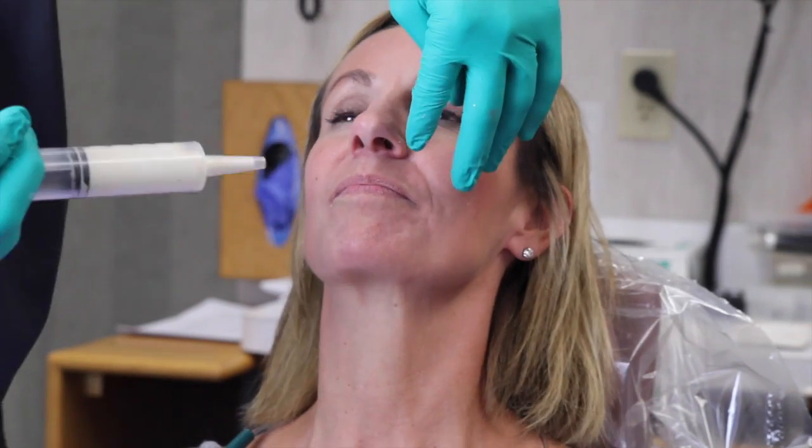And I'm going to wait a little bit until Donna's about halfway through the mix. Now, if I were mixing this, or if Donna were making these impressions by herself, she would just set this down. We have plenty enough working time here. Okay, with that, we're going to begin injecting.